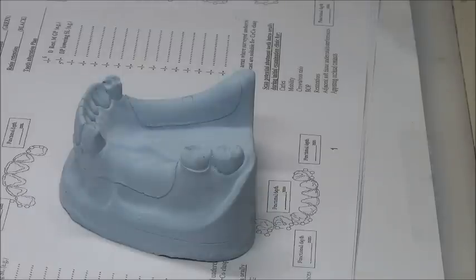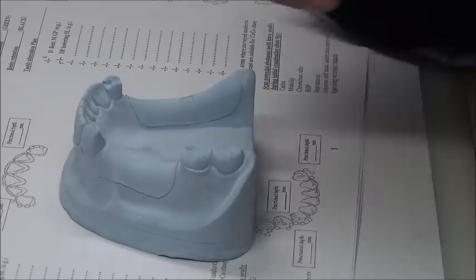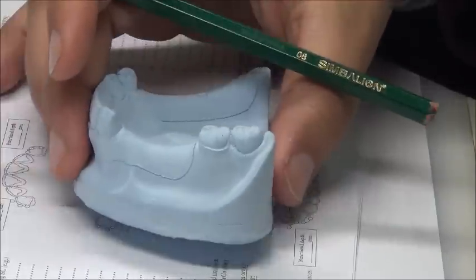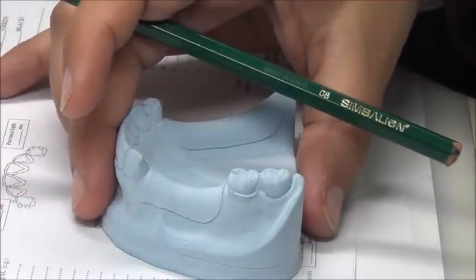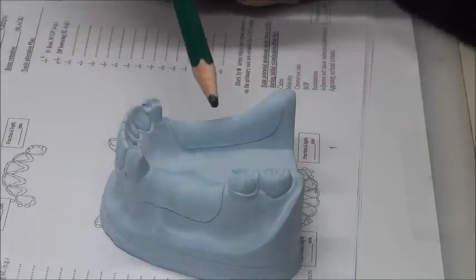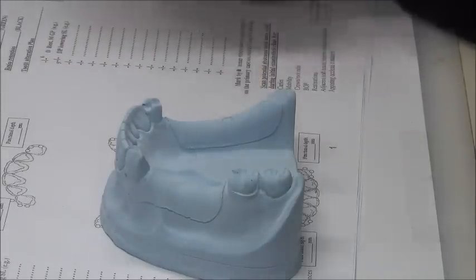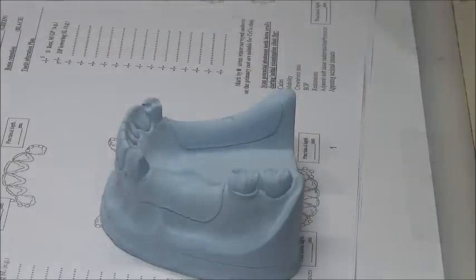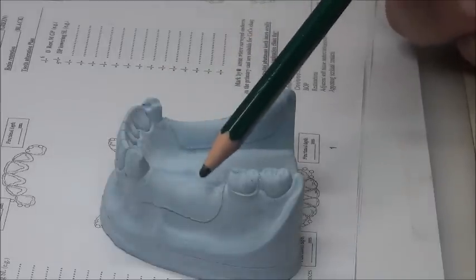In the case we gave you, we changed it to a mesh just for learning purposes, not based on occlusal analysis inside the patient's mouth. For educational purposes, we made you deal with an open lattice to see it and really feel it and look at it and really understand how thick it is. On the other side, you use the mesh, and now you know what a mesh actually is. So we changed this design here just for educational purposes.